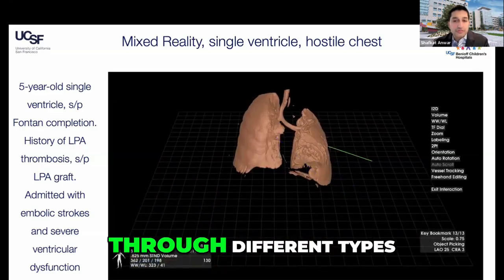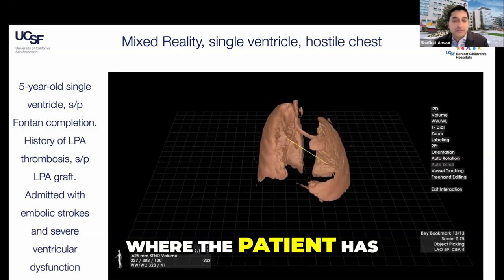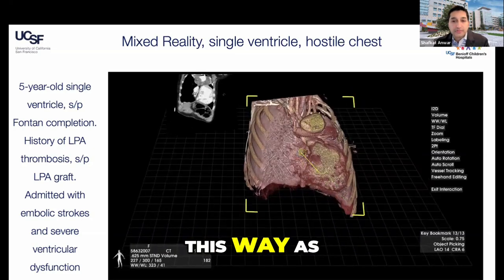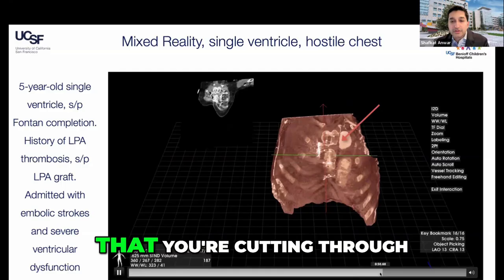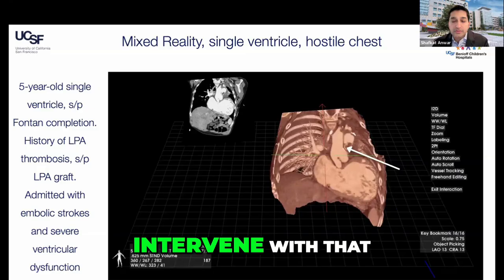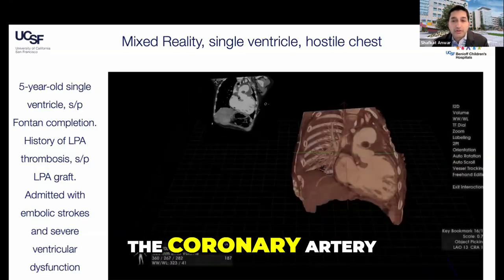You can scroll through different types of visualization modes. So here I'm showing the lungs where the patient has a necrotizing pneumonia. And then you can basically cut through the heart this way as if it's a digital scalpel and you have a cut plane that you're cutting through. Here, I'm basically labeling for the surgeons the areas that they need to intervene with that LPA graft that's clotted, the large pseudoaneurysm, the coronary artery.